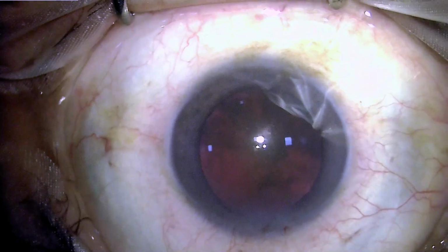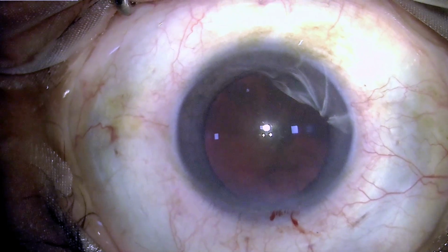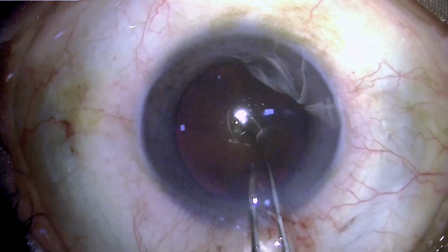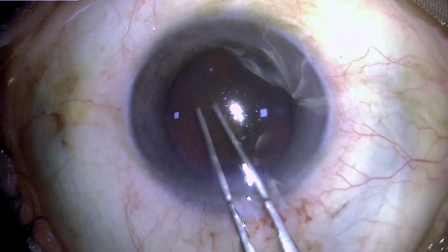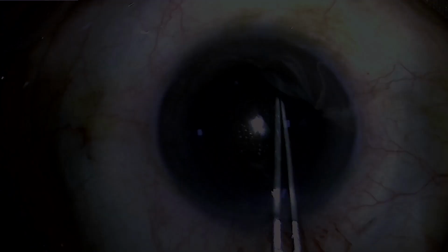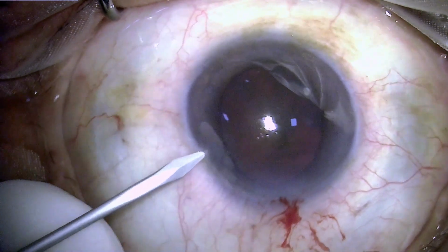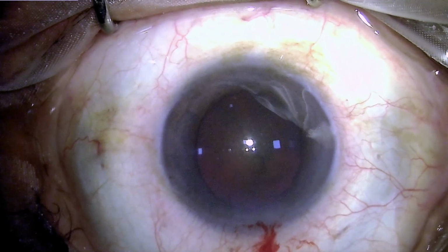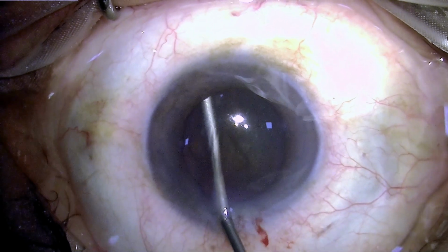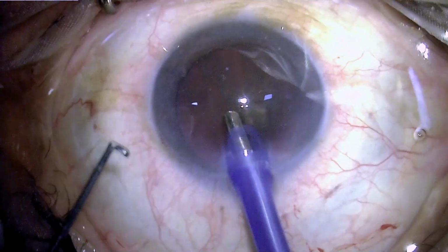And after instilling intracameral lignocaine and viscoelastic, we proceeded for capsulorhexis. So in these kind of cataracts, the capsulorhexis is usually not an issue, as I have numerous times repeatedly demonstrated in videos, because these capsules are not elastic. Proceeding for making a side port and then proceeding for hydrodissection to separate the cortex and nucleus from the overlying capsule. So till now the surgery is going as routine and as planned. There's some amount of pupillary fluctuation, but it is expected.